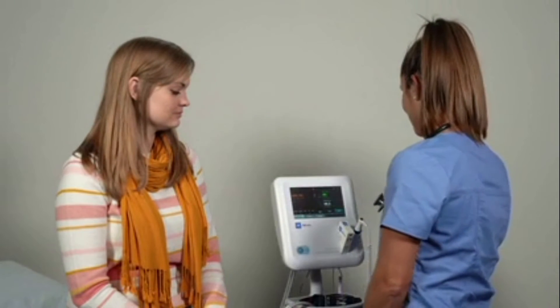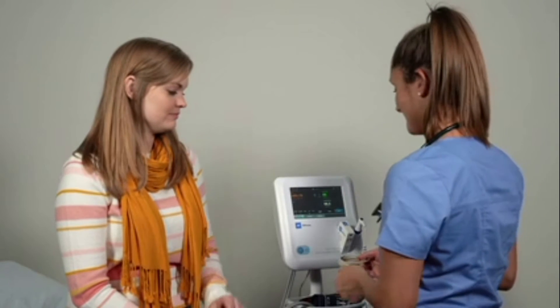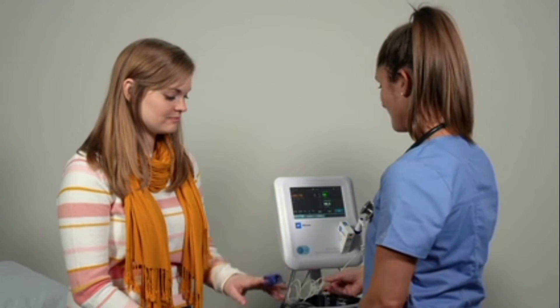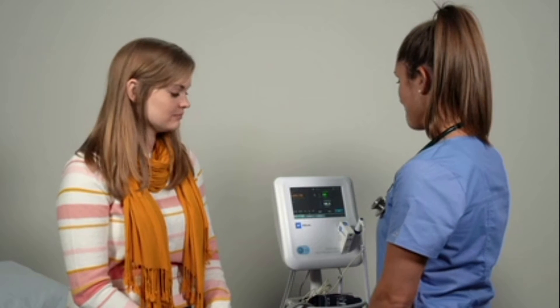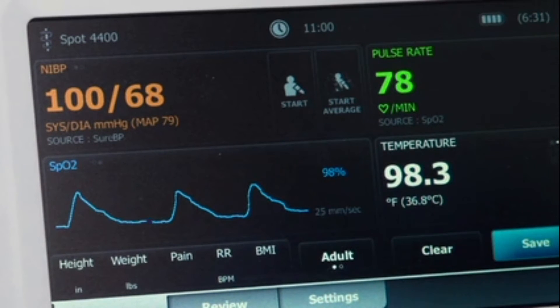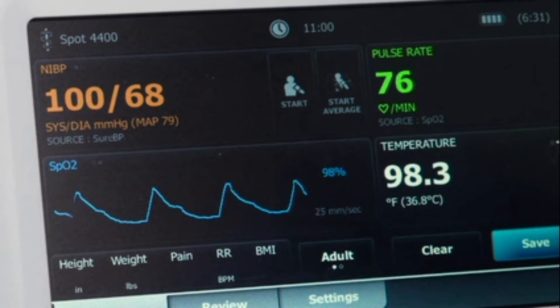For device models equipped with pulse oximetry, the non-in pulse oximetry sensor will automatically capture patient SpO2 percentage when applied. When the pulse oximetry sensor is applied, you can touch the SpO2 tile to display the plethysmography waveform.